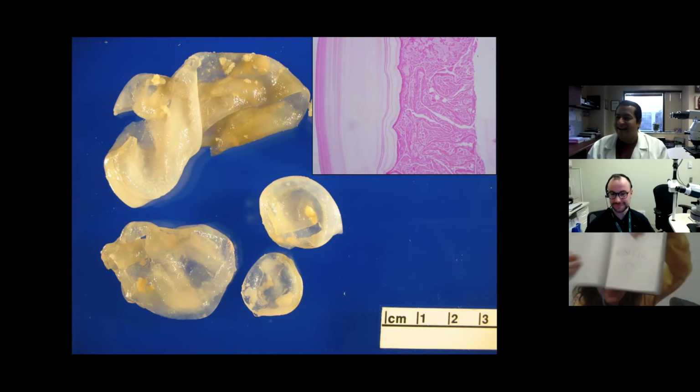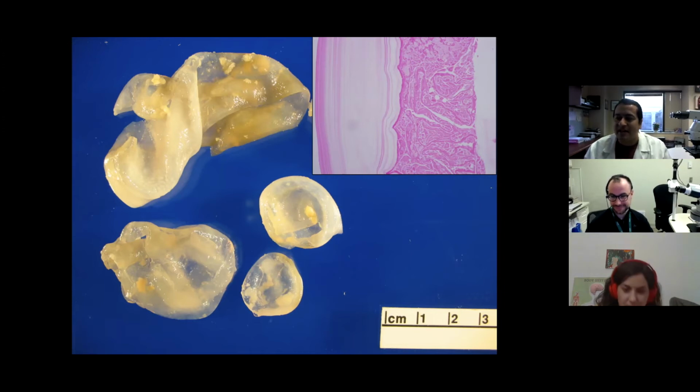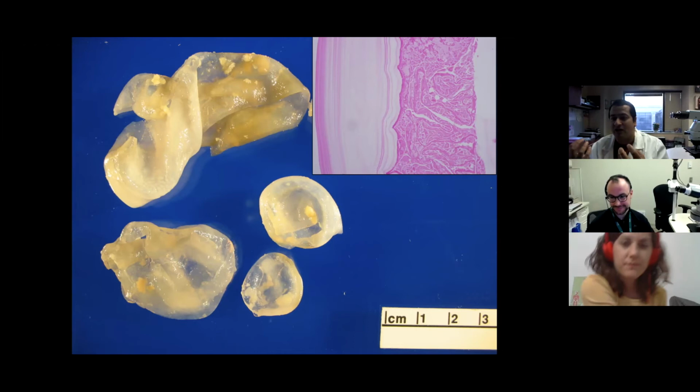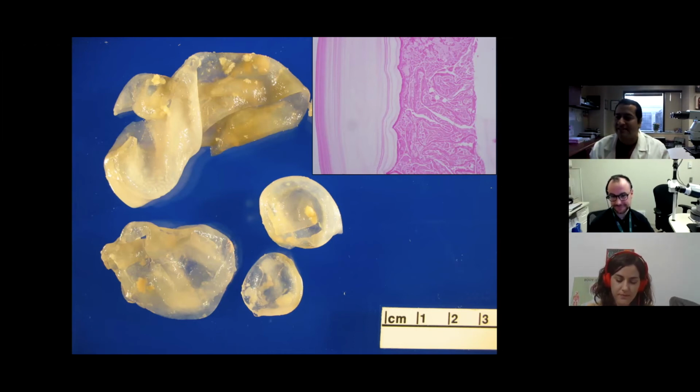Yes, correct. So both are right. They've given you two different names for the same thing. One is echinococcus and the other one is hydatid cyst. So that's exactly what these are. These are cysts that have this characteristic laminated cyst wall. That's the wall of the cyst. And on the inside of the cyst, you actually get little organisms, little larvae, which are not shown here, but I'll show that at some other time, the viable worm. Together, that stuff is absolutely pathognomonic of echinococcus.